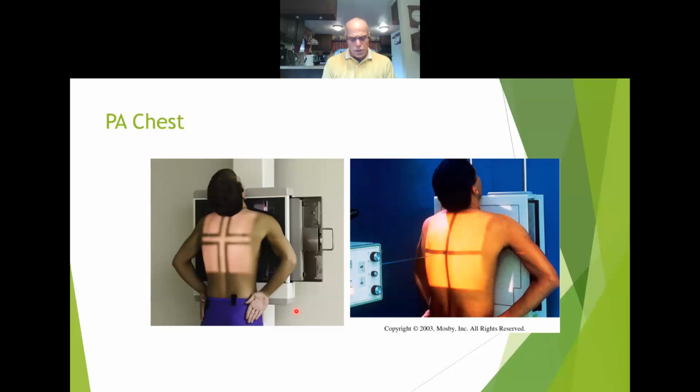Patients sit on a stretcher. Being done on a stretcher, we do this a lot at one of our main clinical sites. Even if they're on a stretcher, we sit them straight up vertically in their bed, and that's still considered erect. Remember, we always want to do our chest x-rays as erect as possible because we're looking for minute little areas, like the costophrenic corners, that may have a little bit of fluid in them, and you're not going to see that if the patient's not fully erect. So keep that in mind.